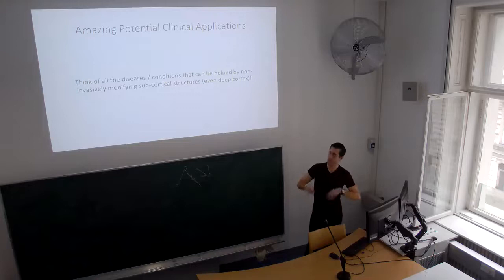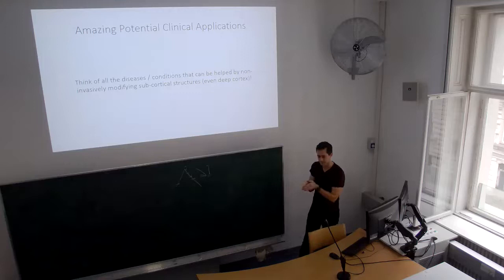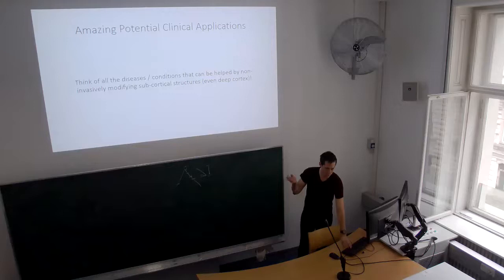But there is amazing potential for clinical applications of focused ultrasound. Think of all the diseases that might be helped or better understood if we could precisely and selectively target deep brain areas, in healthy people or in people that can't undergo surgery. Someone has anxiety, you turn their amygdala down, see what happens. They have depression, you hit their subgenual ACC, which is something I'm going to do. All of these things, think about that. A lot of low hanging fruit there because no one's done it yet.